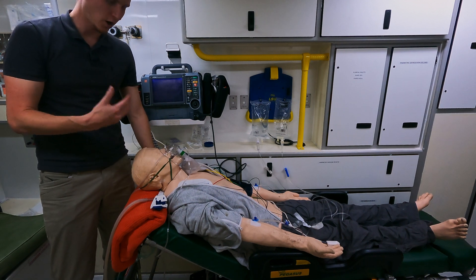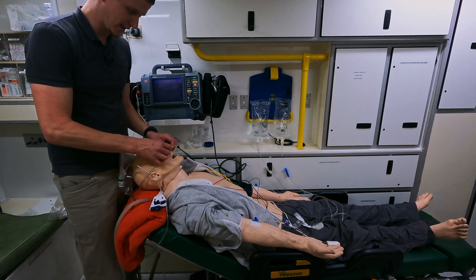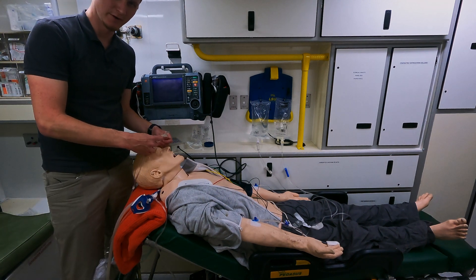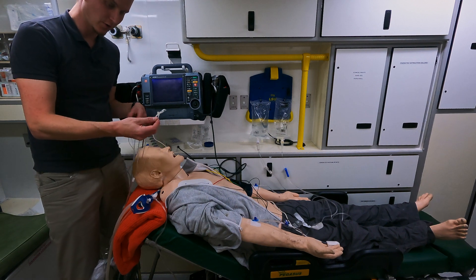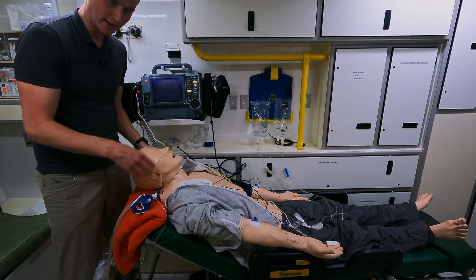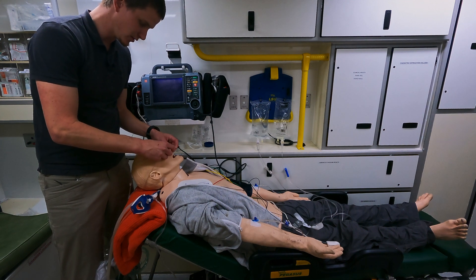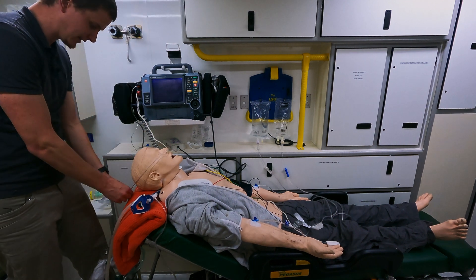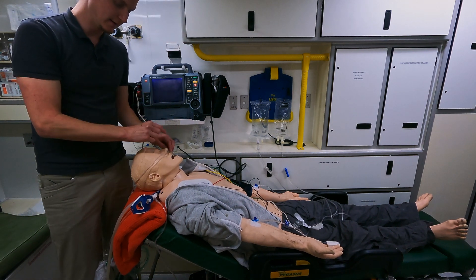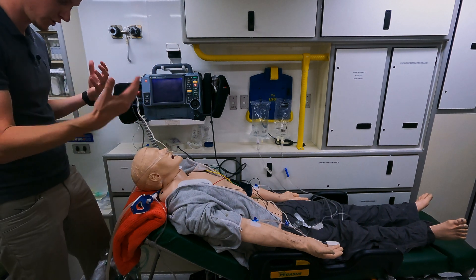Then O is for oxygen. As you can see, we have this patient pretty prepped for no DSAT. We have an ETCO2 nasal cannula so we can track nasal ETCO2, but also a normal nasal cannula. Why? Because the ETCO2 nasal cannula can't actually push 15 liters through like a normal one — if you look closely, there are holes in it that don't push the oxygen where it needs to go.